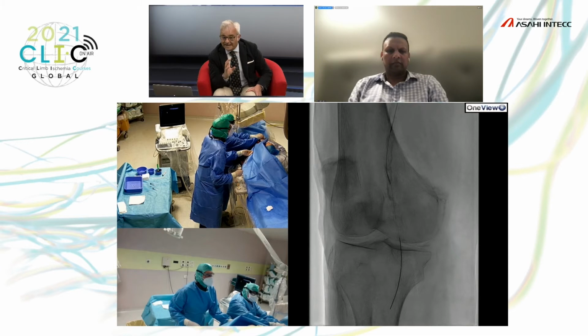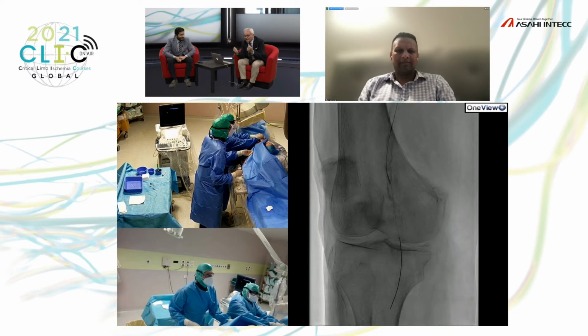for me it was a little bit difficult to learn how to move this wire. I mean, the name is guide wire. You have to drive to guide the wire. It's not the wire going exactly always in the proper track, in the proper path. Well, but this is a concept, probably the first concept I learned from you, that you never push the guide wire, but that you drive, you guide the guide wire. Yeah. So maybe this is a new generation of guide wire that needs to be, yes, guided.